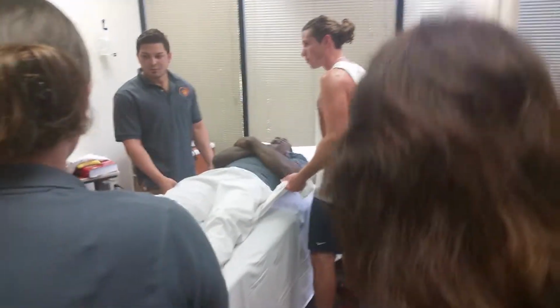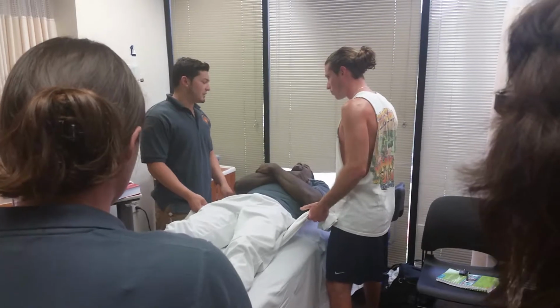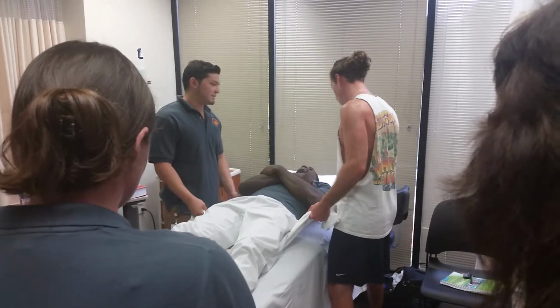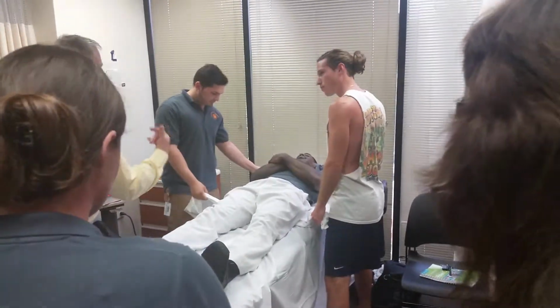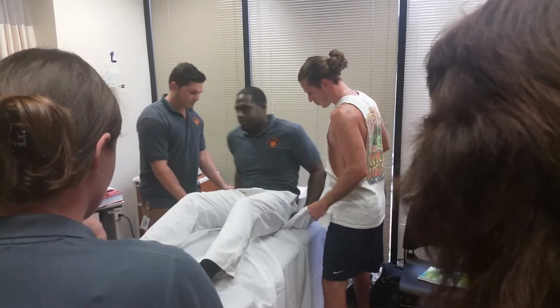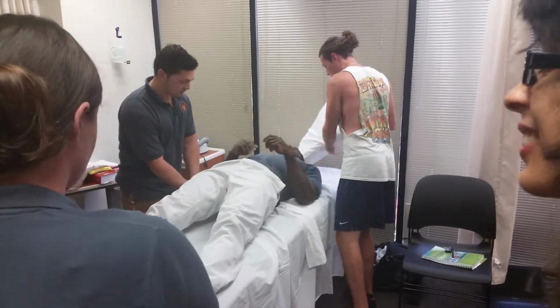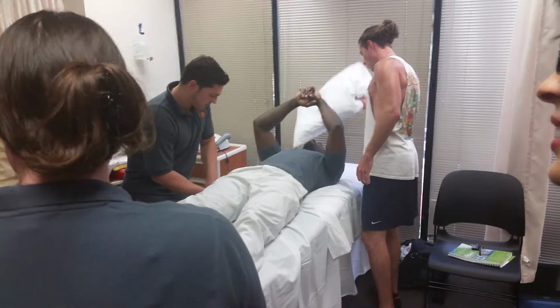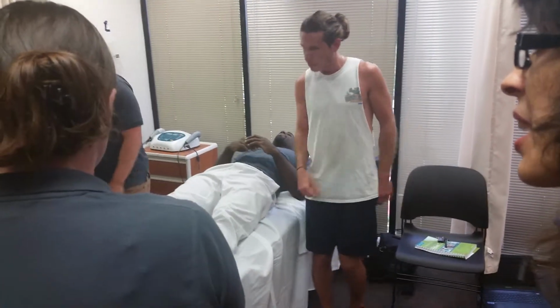So who's going to say on 3? Who's going to lead it? I'll say it. Okay. On 3, we're going to scoot you all the way up. All right. 1, 2, 3. Okay. Greg, if you come back down in the same position. Danielle and Joe, Jess, you two do the same thing.